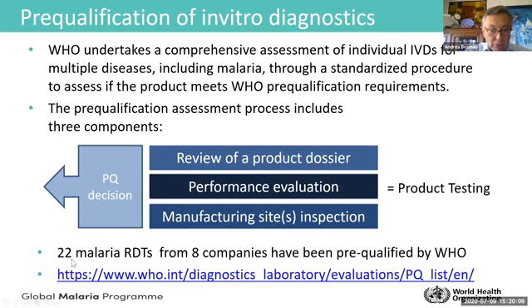At the moment, there are 22 malaria RDTs which are pre-qualified. They are produced by 8 different companies. And if you click on this link, you can get to the page and see which ones are quality tests.